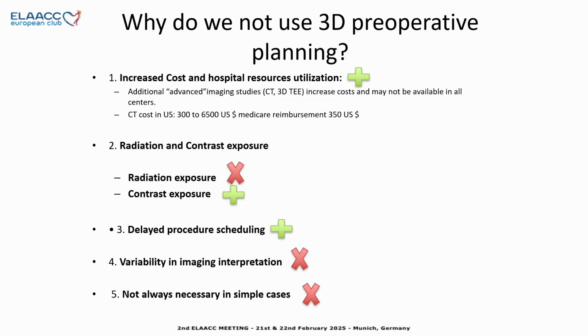So the question is, why do we not all use the 3D preoperative planification? I think the first reason is the increased cost and the hospital resources utilization, because in all centers all over the world performing the technique, they may not have all the 3D modality resources, and there is obviously a problem of reimbursement, particularly for CT.